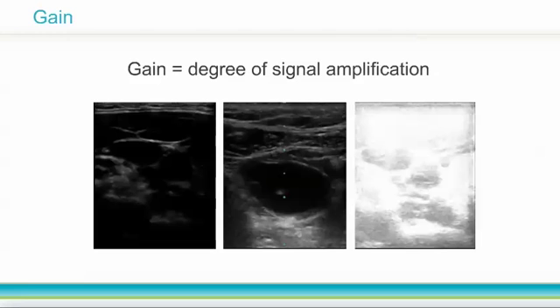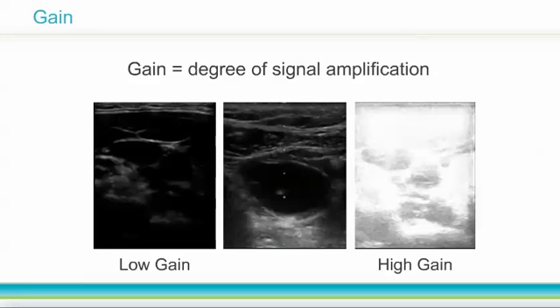Gain is the degree of amplification applied to signals returning to the transducer. It can be thought of simplistically as brightness control. Low gain will drop out some signal altogether and result in a darker screen. High gain will amplify signals more, resulting in more artifact and a brighter screen. Optimal gain, like the image in the middle, will provide the best grayscale to differentiate between structures in the image.